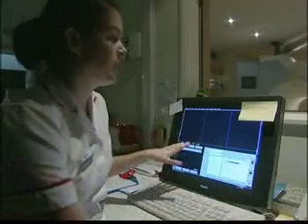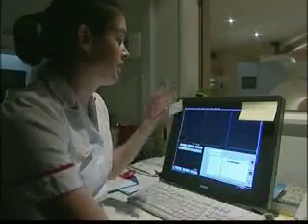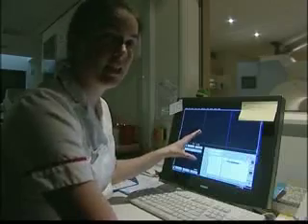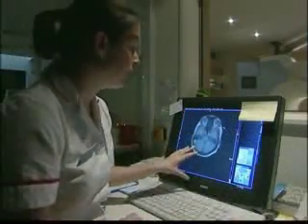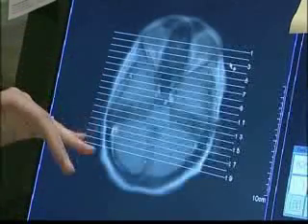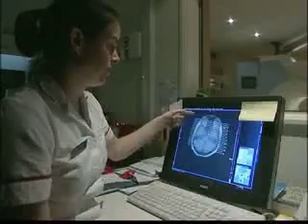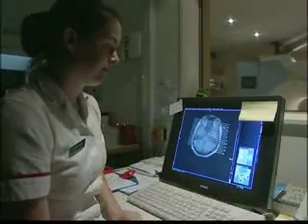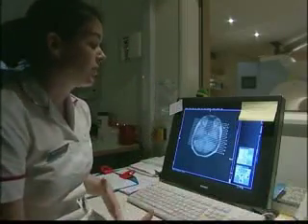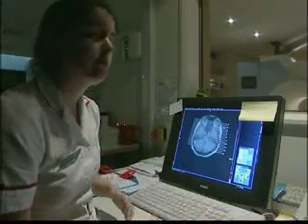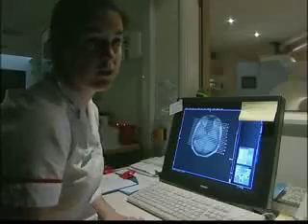We're just going to start the scan now. What we do first is an initial pilot scan, so that's where we can exactly locate the patient within the scanner. With MRI, it's possible to choose any direction for the image slices. In this case, the radiographer is taking an axial pilot scan to give a series of coronal images. We've planned to scan through that area of this person's head, scanning from front to back. Each scan takes about five minutes, and then after that we can have a look through the images and see what we've got.